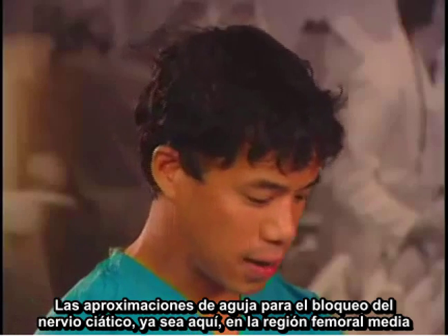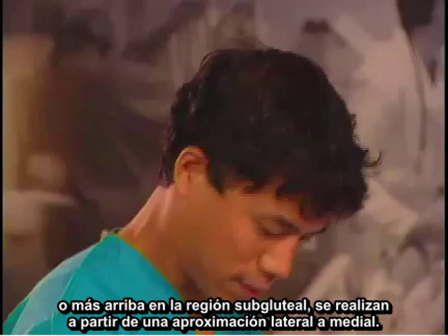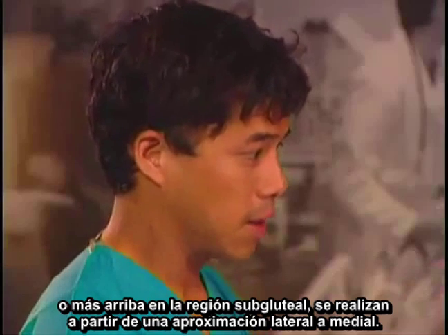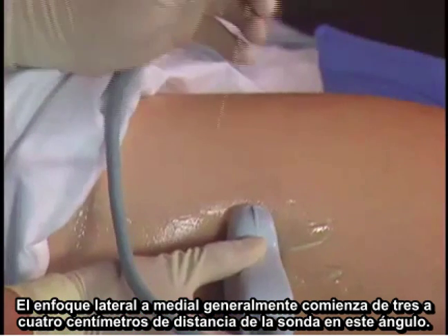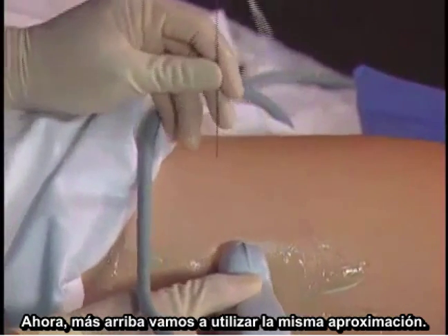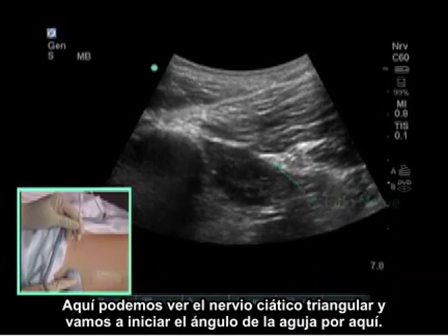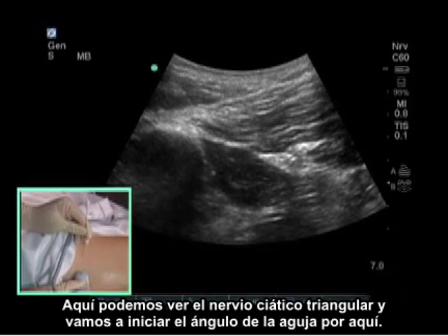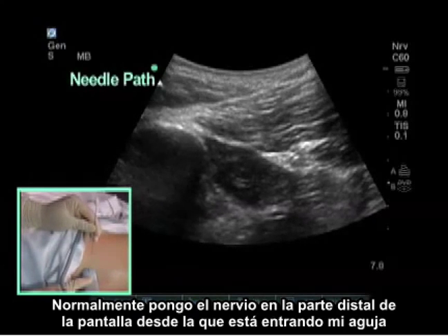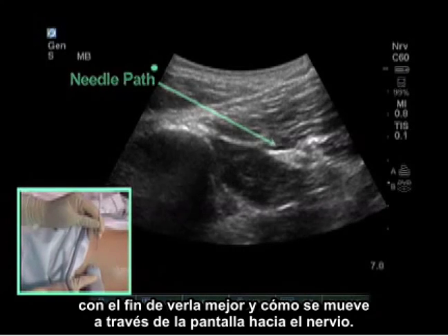Needle approaches for the sciatic nerve block, whether at the mid femoral region or higher up at the subgluteal region, are performed from a lateral to medial approach. This typically starts three to four centimeters away from the probe. I typically put the nerve on the distal side of the screen from where my needle is entering, in order to see the needle better traveling across the screen to the nerve.